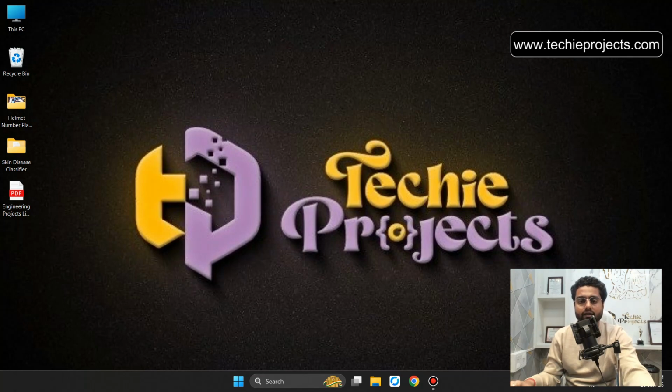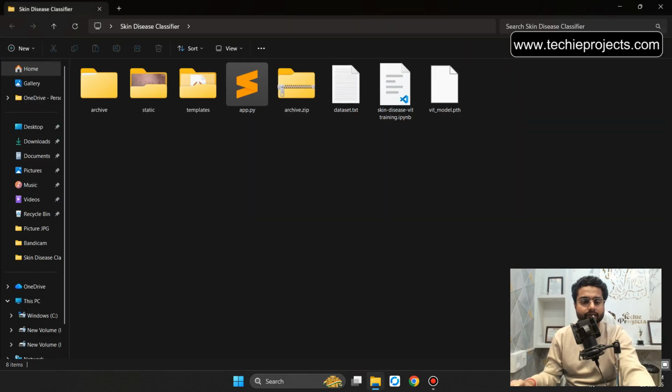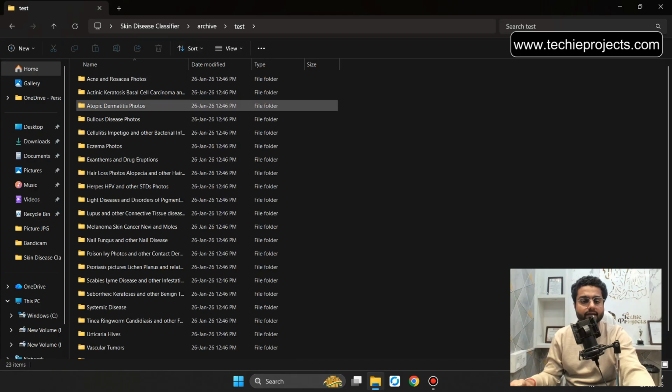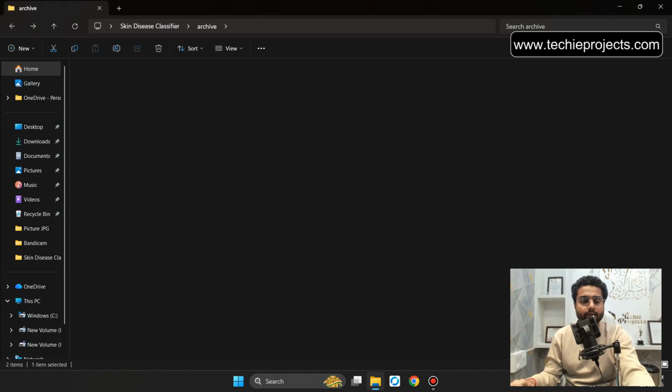So in this video, I will show you the skin disease classifier project using machine learning. So this will be the project folder. Let's open it. Now the first folder, the archive, will be the test and training dataset. Those are the dataset. Let's open the training folder.